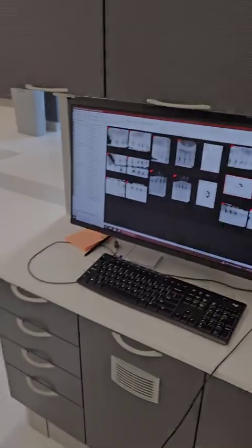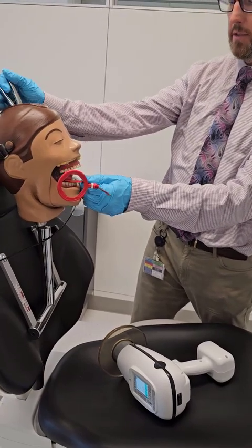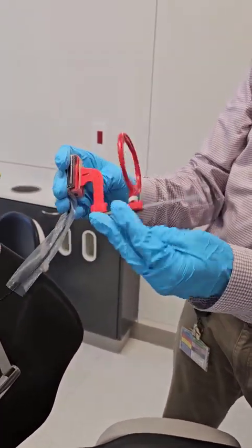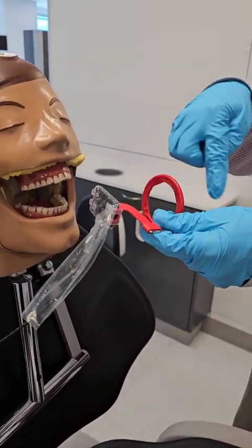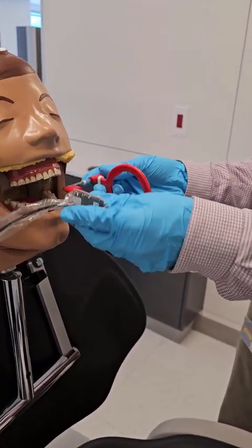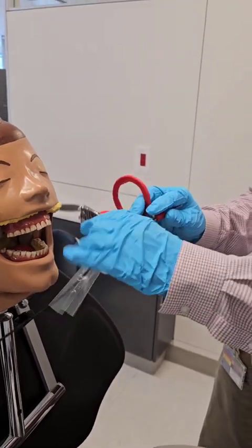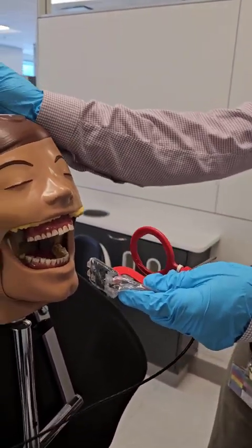Let's go ahead and jump to the other side. Just moving to the other side of the bite wings — just like with the anterior PAs, you don't need to change anything with the ring and the tab. You just flip it over to the other side. Make sure the rod's coming out of the mouth. I've seen students try to do this and then they're shoving the patient's lip back there — that's not going to be comfortable, not going to work very well. So just flip it out so everything's coming outside of the patient's mouth.